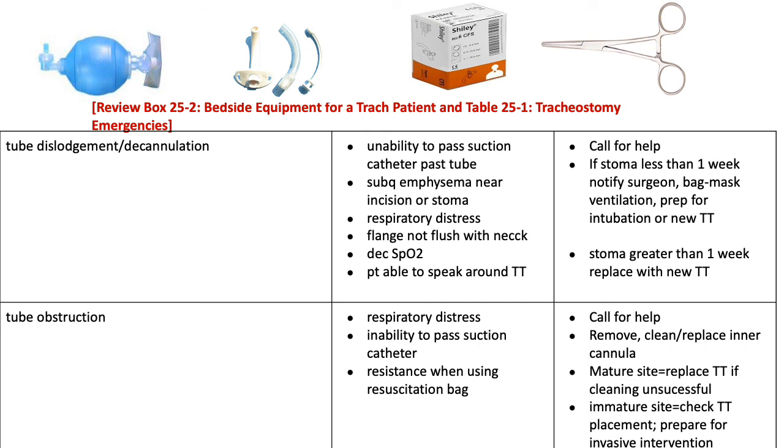Another unexpected outcome would be tube obstruction. The tube becomes obstructed. It could be obstructed with mucus, like a mucus plug, or it could be obstructed with a clot if there's any bleeding postoperatively. Some of the signs and symptoms would be respiratory distress, inability to pass the suction catheter, or resistance when using a resuscitation bag. So you think your patient needs to be suctioned and you hyperoxygenate with the resuscitation bag and you meet a lot of resistance.